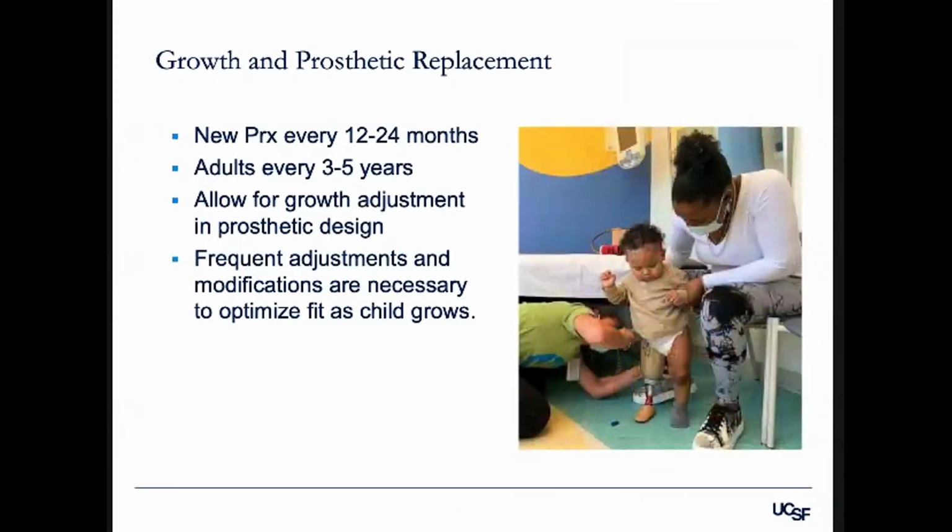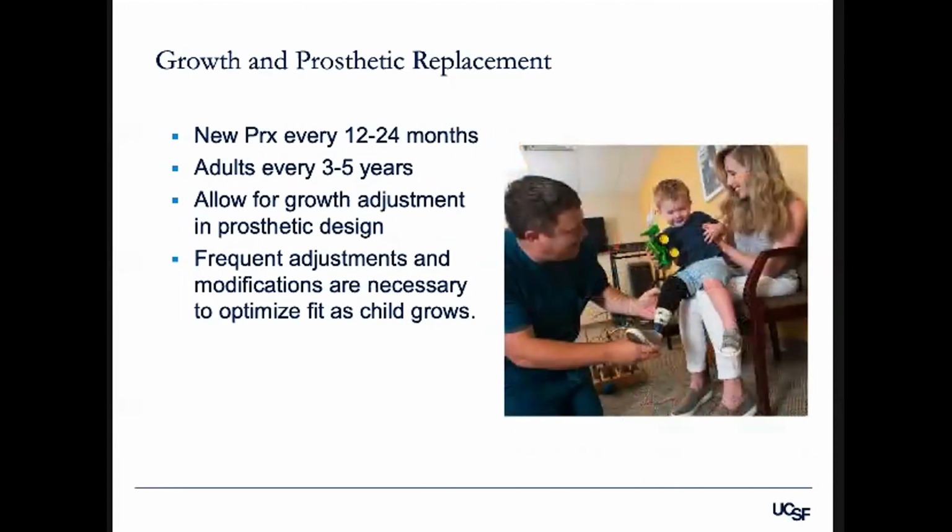For prosthetists such as myself, fitting a growing child is absolutely one of the greatest challenges, in designing a system that the child will not outgrow too quickly. That is certainly an ongoing challenge that we face. And of course, as you can imagine, the prosthetist should always be consulted for modifications to the prosthesis to extend the device's usable life as the child grows and to accommodate any issues that might surface.